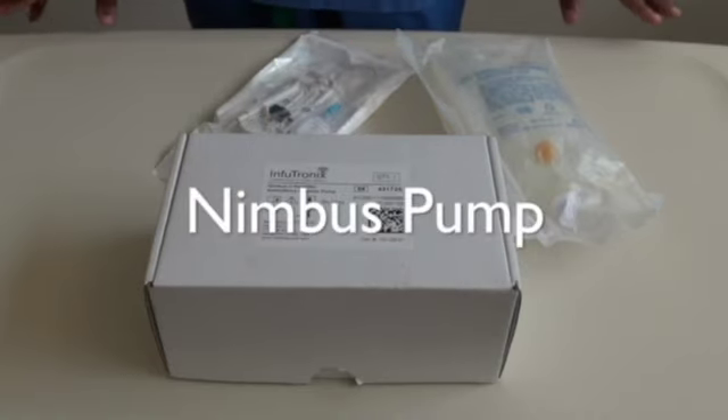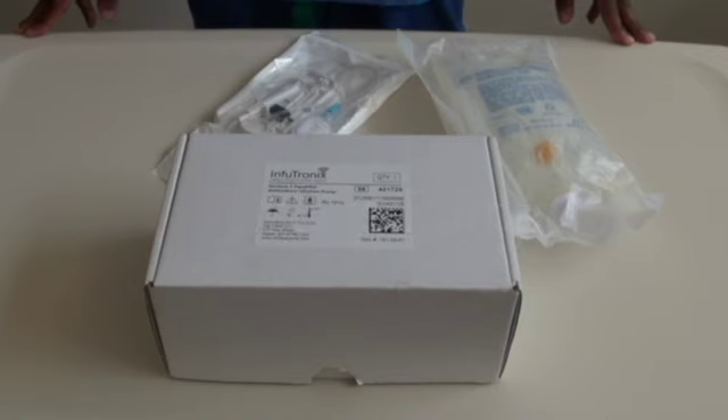The purpose of this video is to demystify the Nimbus pump and to help with some common calls that you may get whilst holding the OSC pager.